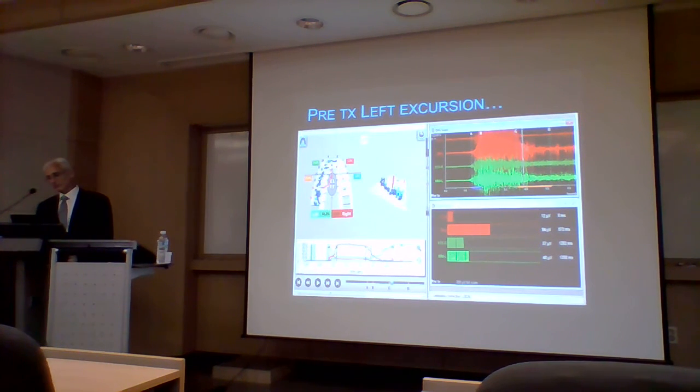And then here we see after the C line, very high muscle firing in the left temporalis and the right and left masseter muscles.